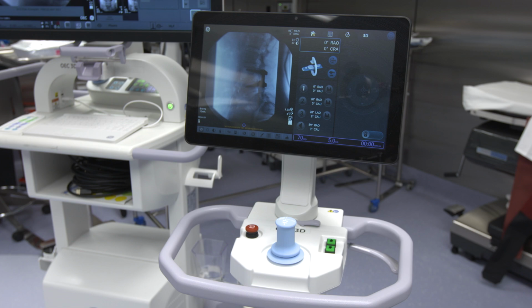When I line up a view to a pedicle or a specific part of anatomy, I'll tell the technician to save that shot, save that position, and then I'll go to another position, and then the technician can automatically go back to the last position very quickly and easily. That is one of the biggest frustrations that we have, is finding that last view that we had 10 minutes ago.